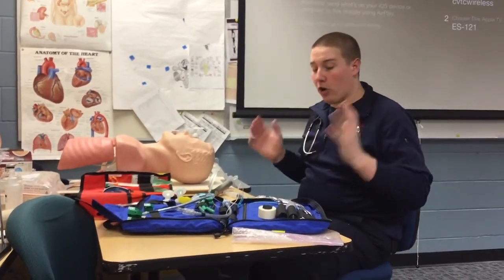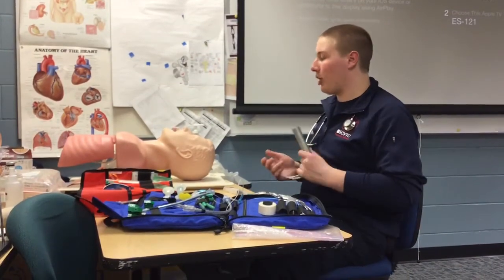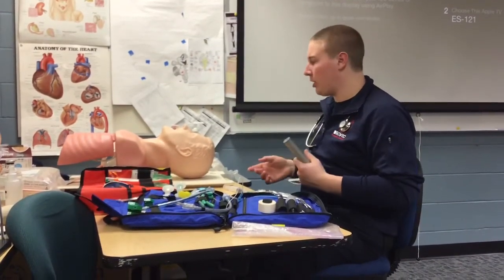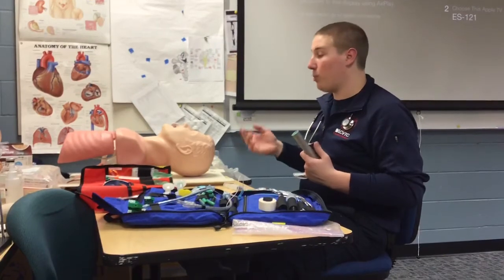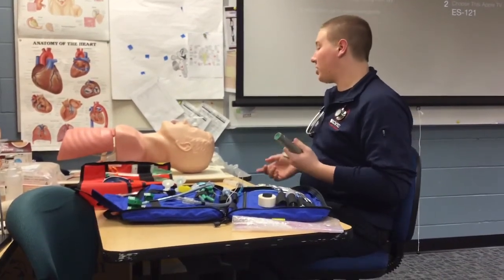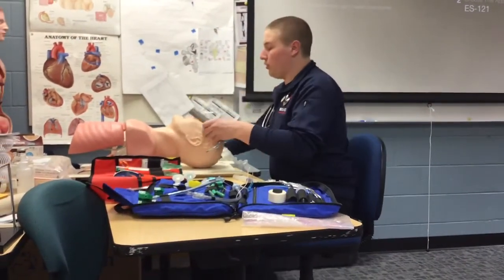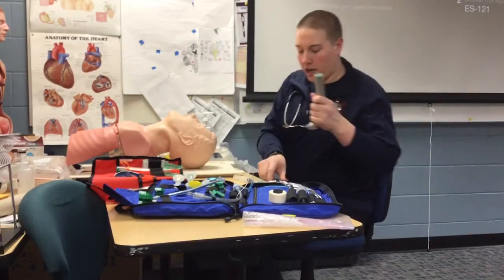So after I have all my equipment set up, I would tell my partner after the next breath to remove the OPA, which is inserted, which he's using to pre-oxygenate the patient. So after the next breath, remove the OPA. So OPA is removed. Position the head how you want it.